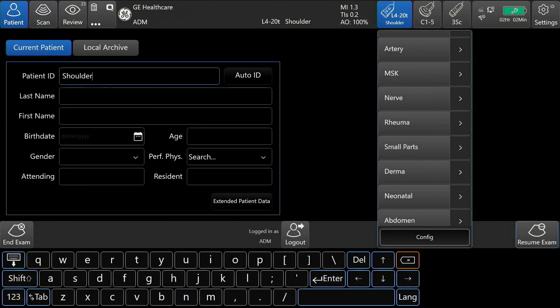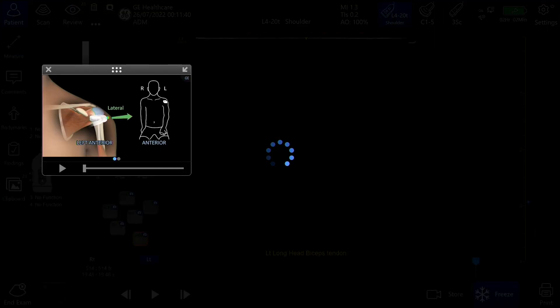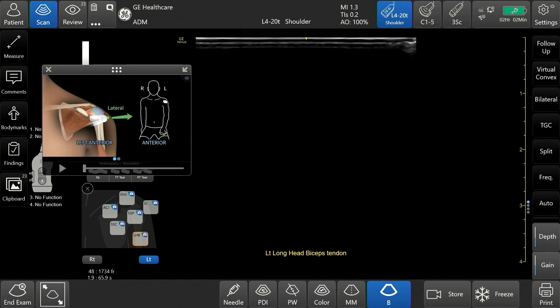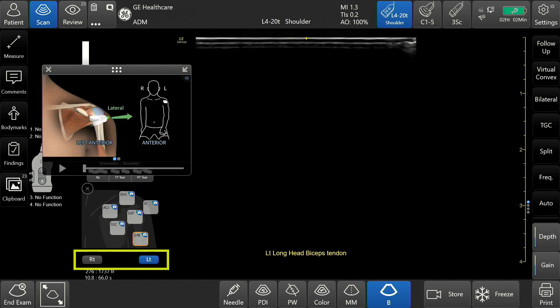To begin, select the correct probe and preset from the patient page. In this case, I will select the L420TRS probe and the MSK shoulder preset. The shoulder diagram and reference images appear on the left side of the screen. The left or right side of the shoulder can be selected by tapping left or right. I will start with the right.